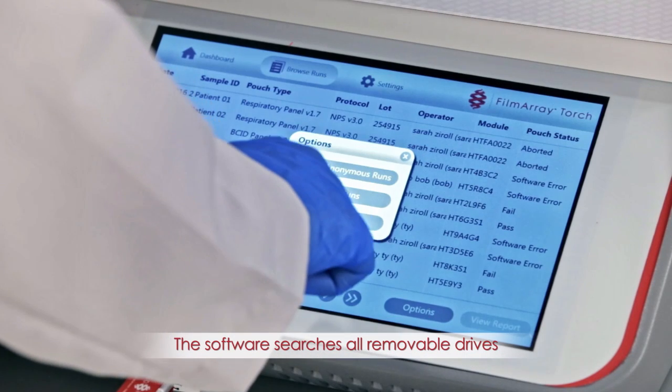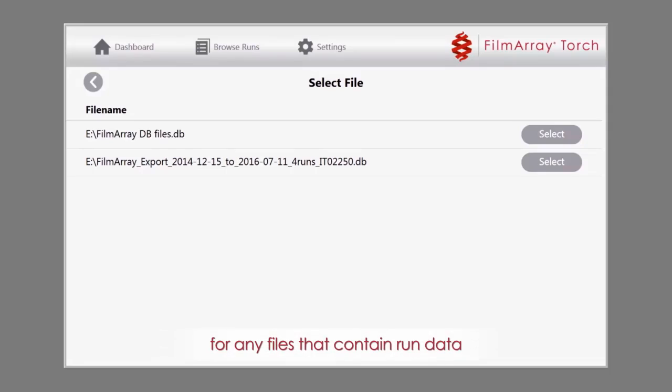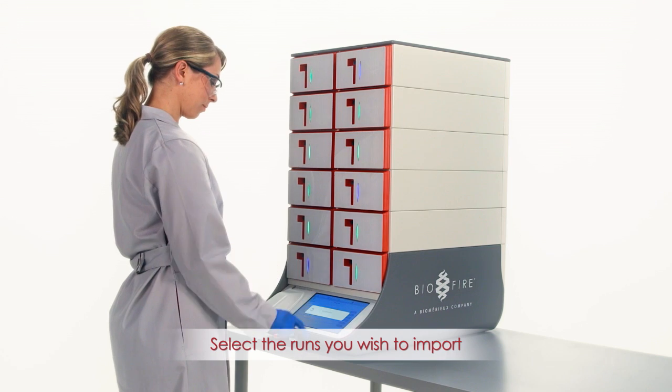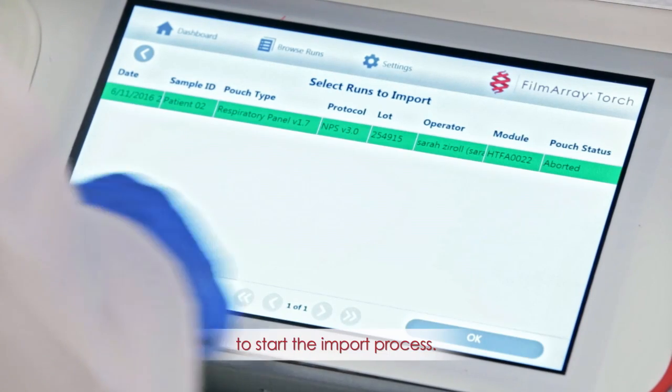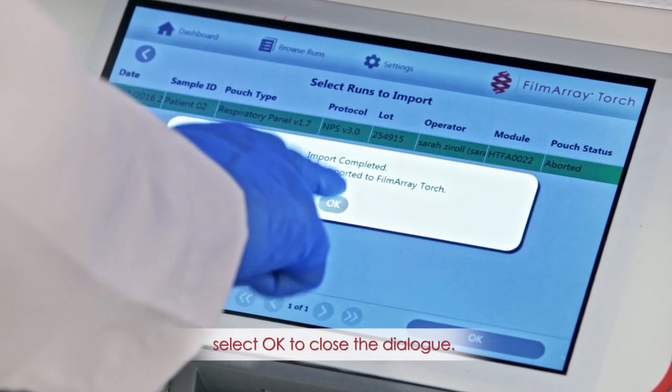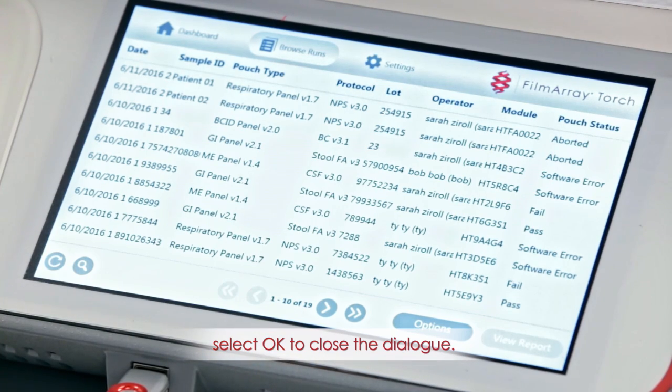The software searches all removable drives for any files that contain run data and will present these files for selection. Select the runs you wish to import to start the import process. During the import process, the Import Runs dialog will display the progress of the runs being imported. When the import is complete, select OK to close the dialog.